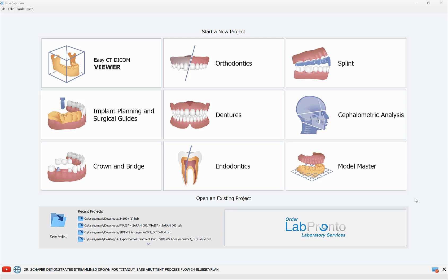Hi everyone, this is Michael from Blue Sky Bio. In today's tutorial video we will demonstrate a super simple process flow for crown-down implant planning. After we create the surgical guide, we will create the crown for a titanium base immediately afterwards. Everything is directly in the Blue Sky Plan version that you already have, and the generation, design, and export of the crown is completely free — it could then be milled or printed.